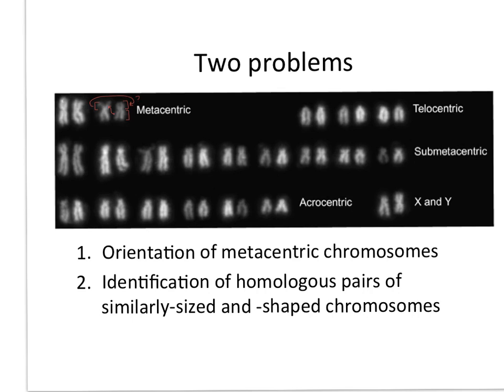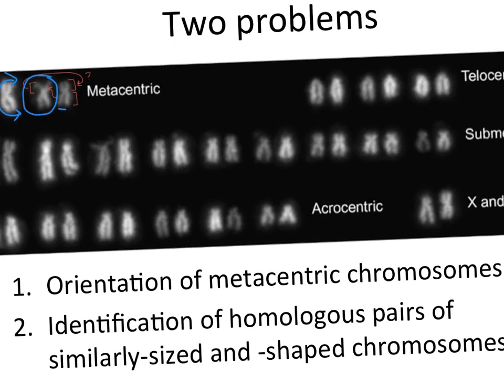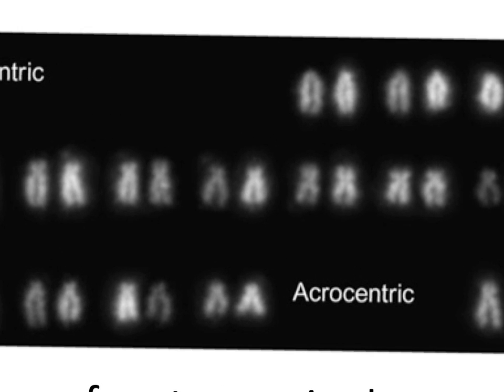Maybe one of these chromosomes is meant to be flipped in this orientation to line up properly with its homologous chromosome, the one next to it. And a related question is, are we really convinced, for example, looking at these chromosomes here?